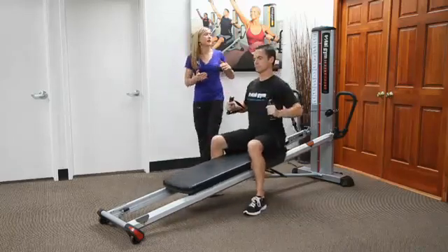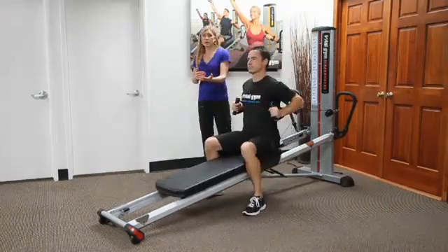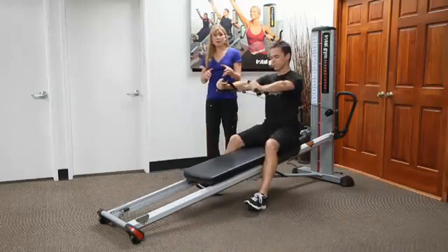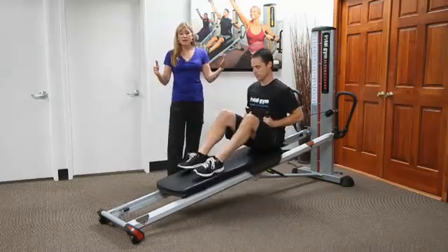Now with the power tower, I can easily adjust while he's moving, but sometimes we don't want to do that because we might want to transition into another exercise. So it's a really nice way to accommodate for strength right away. Now if you want to make the exercise harder, he can place his feet up. So we use the word straddling or staggering.